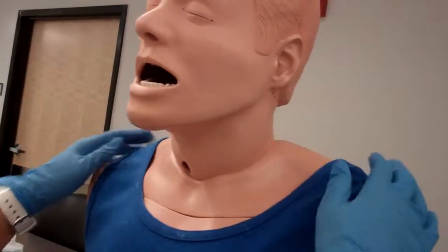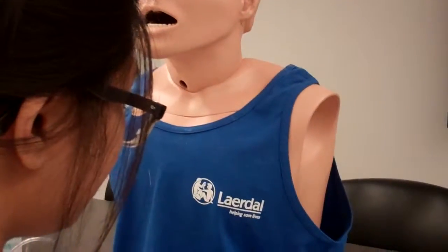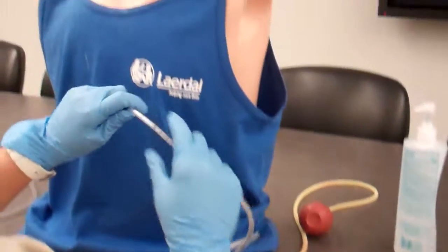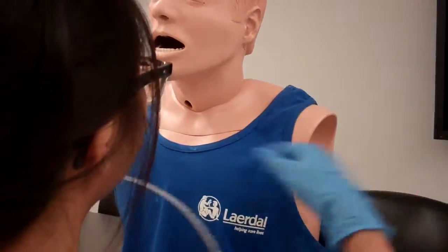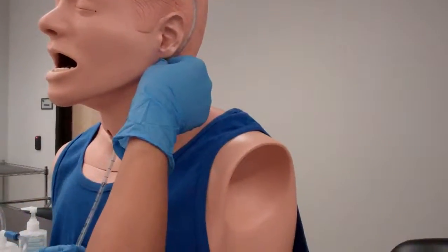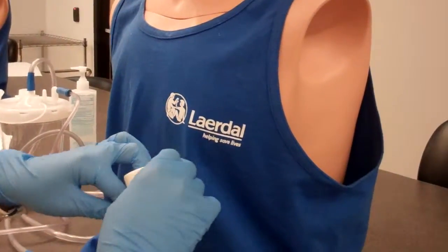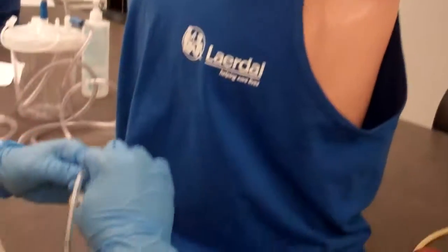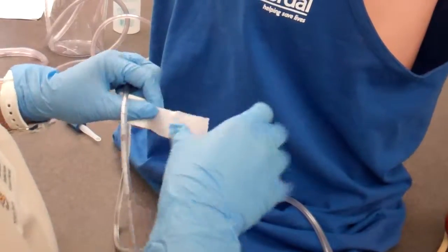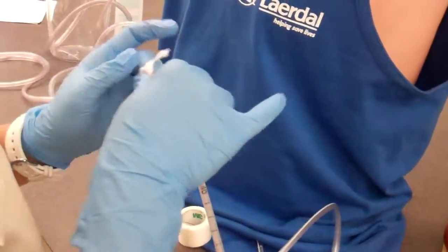Okay. So at this moment I would put a cloth on my patient. And I would also have beside me a cup of water. And now I'm going to measure the tube from the nose, around the earlobe, and down to the xiphoid process. And right now it measures up to 50. So I'm going to mark it at 50. Okay. At 50.